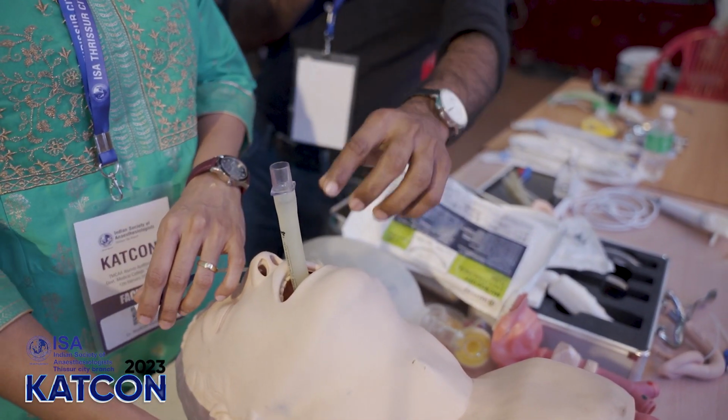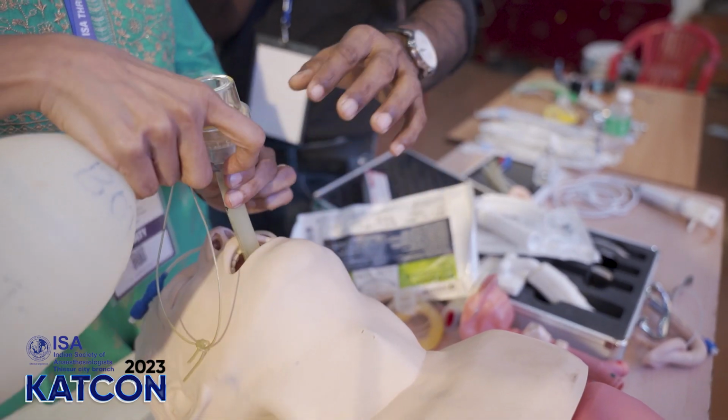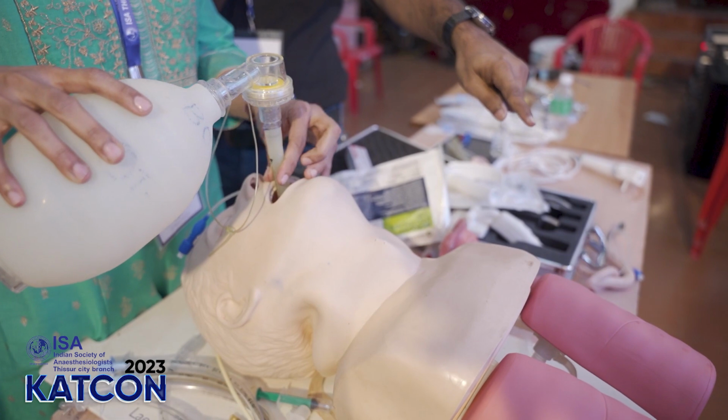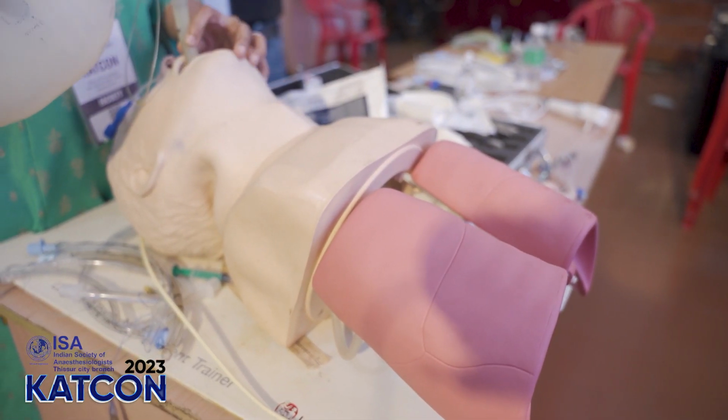So what happens is, now the LMA seats itself. Now you can connect the circuit and check for ventilation. See that the lungs are getting inflated. So this is how you do an LMA.